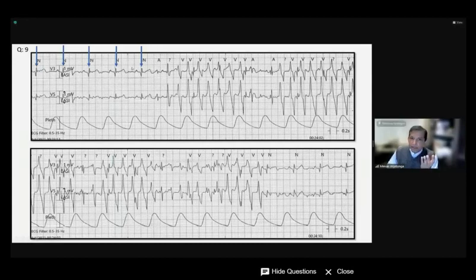And then what I try to do is, when you find the QRSs that you know are clearly QRS, you try to match them to it. So I put a caliper and try to see, well, do I see anything there? Not sure. That's why I highlighted in this yellow orange color. Blue means I know for sure this is a good QRS. I march out. Huh, yes, now I see. That QRS looks identical to that. So this must be a QRS. Once you see this, you clinch the diagnosis, right?